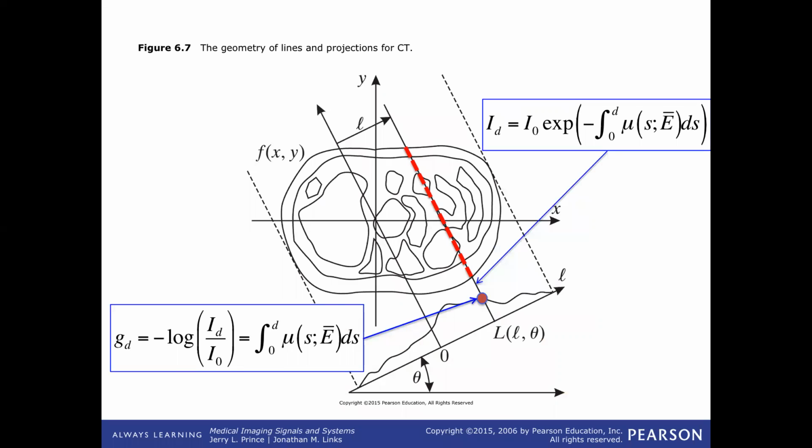This is extracted straight out of our 280A course. You'll remember it, those of you who took the course, in setting up the geometry of doing computed tomography. And I put it here because a lot of what we're going to talk about next is precisely the same as used in computed tomography, in that once we modify our data that we measure in computed tomography, we get a function that is essentially equivalent to brightness in nuclear medicine, or intensity of radiation at a point, right?